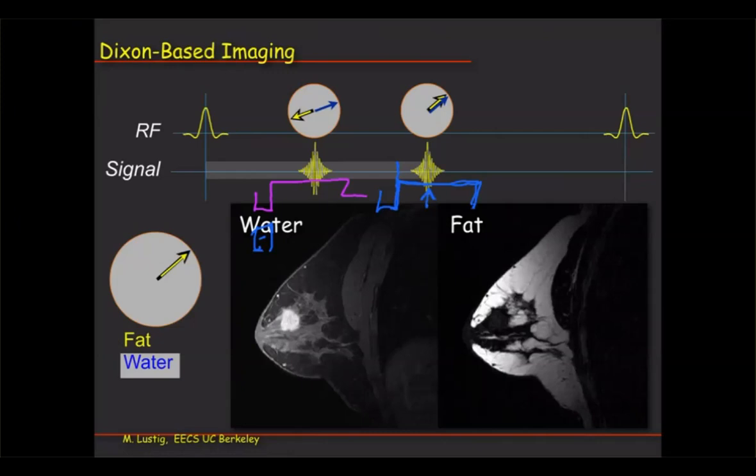What you do basically is you read K-space, you go out in K-space, you read one line, and then you read the same line on the way back, for example. And that gives you the opposed phase. Or alternatively, going backwards can sometimes be problematic. So what you do is you rewind it, and then the second echo is collected in the same direction, okay, on top of it. And then the next time you excite, you do the same thing, but for the second line, and so on and so forth. So you'll get two images out of this acquisition.